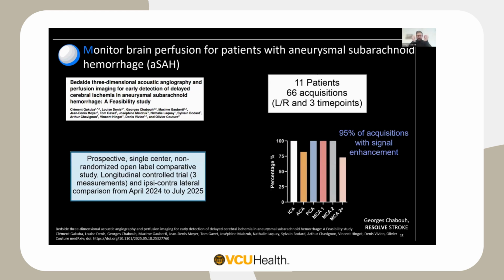So let's quickly go to the clinical trial that we've done. It was in aneurysmal subarachnoid hemorrhage in France in the neuro ICU. It was 11 patients where we did 66 acquisitions. So it's 3 time points, left and right.